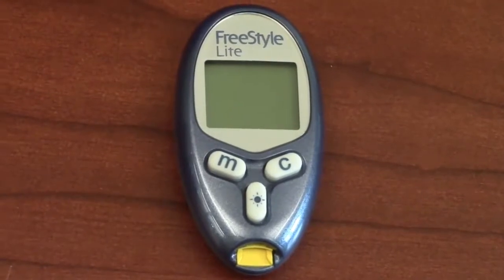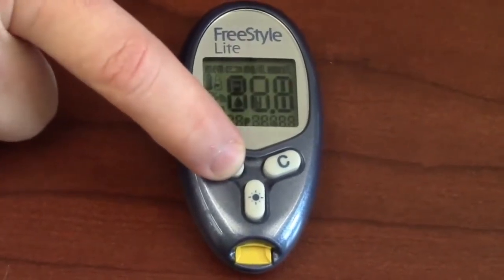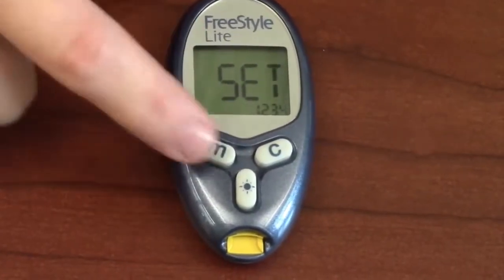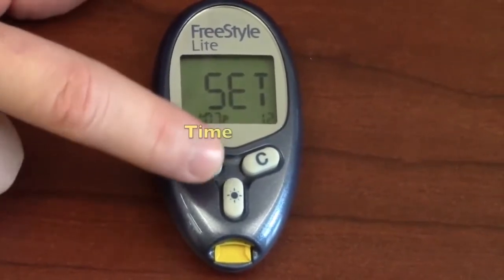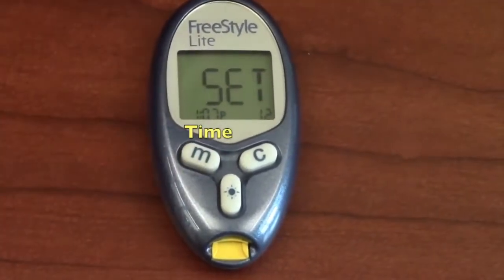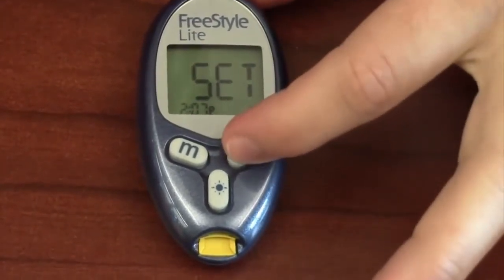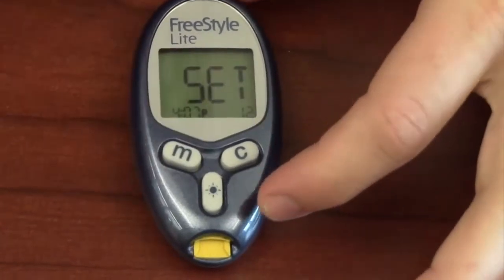To set the date and time on a Freestyle Light, you press the M until you see the word 'Set' appear. Once you see that word, you press M until you see the time appear at the bottom of the screen. To adjust the time, you press C until you get to the hour that you want, and then press M to confirm.